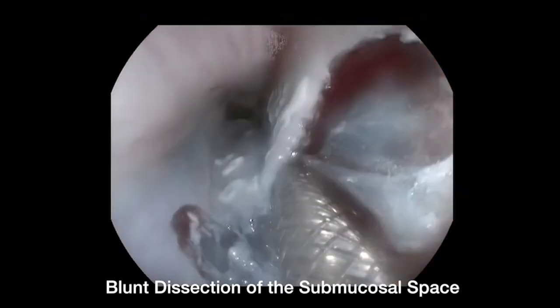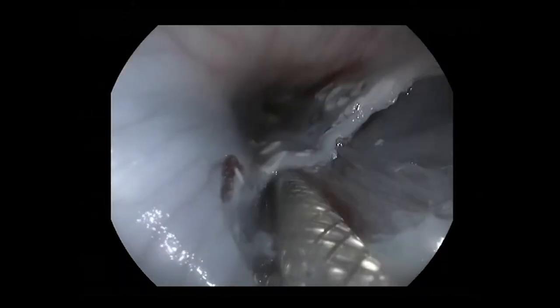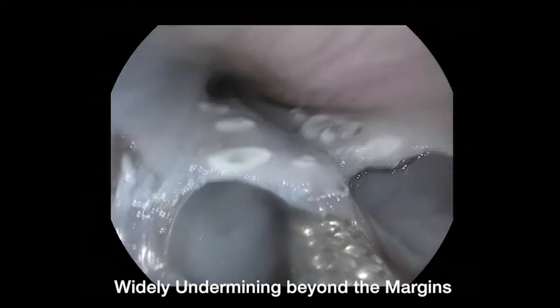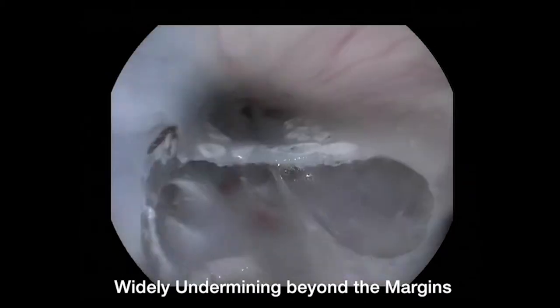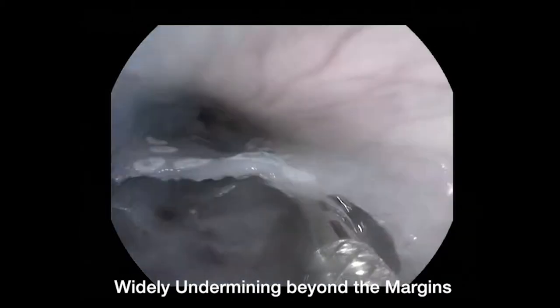After the incision, the catheter is now advanced carefully into the submucosa, which is mechanically separated so that a tunnel is created. The endoscope is then introduced into the tunnel from proximal to distal and a large submucosal space is bluntly dissected using the endoscope and the mechanical catheter.